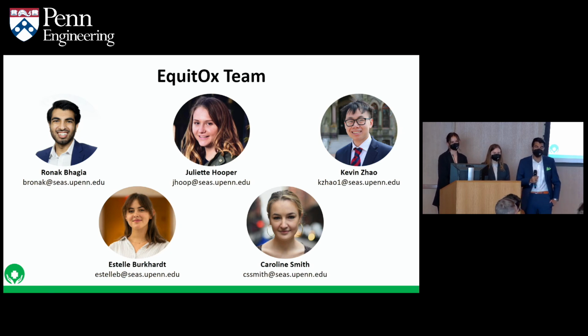Thank you. Great presentation, you guys. I had some questions about what thoughts you had on failure modes for the device with respect to your design process. Things that came up for me: how would nail polish affect this? You have these sterile covers. What if they bunch up and affect the measurements or the positioning on the tongue? I was curious if you could speak to how you've thought about those different modes of failure.